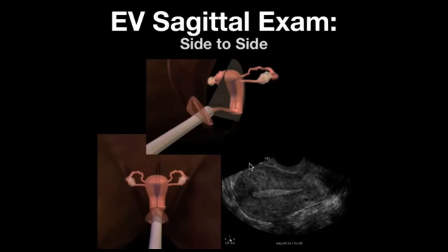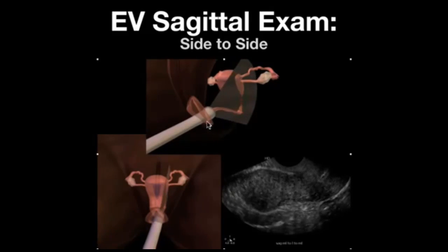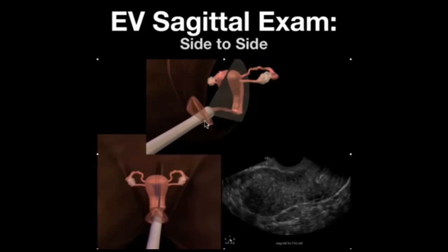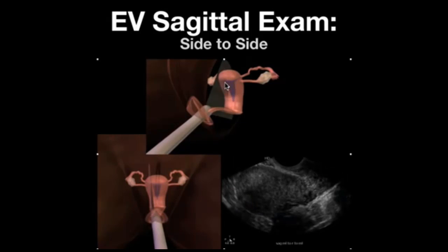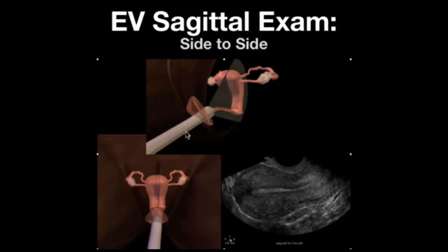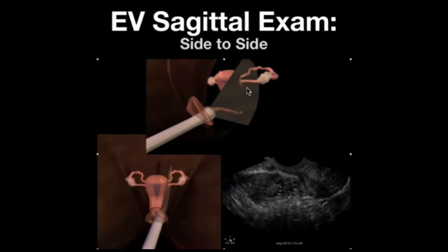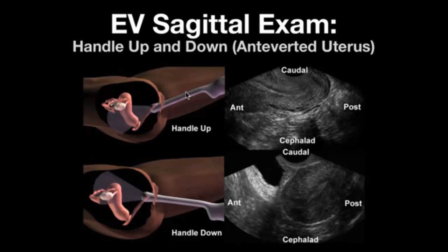Scan the whole uterus. On the endovaginal sagittal exam of an antiverted uterus, you can see the myometrium, endometrium, and posterior cul-de-sac. Sweep from side to side: bringing the transducer toward the patient's left thigh visualizes the right side of the uterus, and bringing it toward the right thigh visualizes the left side. In addition to side-to-side sweeping, bring the handle up to better visualize the lower uterine segment, cervical region, and posterior cul-de-sac in an antiverted uterus.